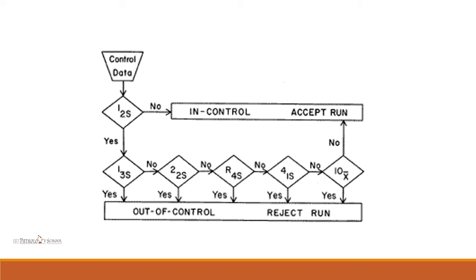This flowchart shows how Westgard rules are interpreted. When a control sample is run and data is obtained, we apply the 1-2S rule. If positive, we check the 1-3S rule and label the specimen out of control. If not positive, the specimen is in control. Consecutively, we look for 1-2S, 1-3S, 2-2S, R-4S, 4-1S, and 10x. If any one rule is positive, the run is rejected.